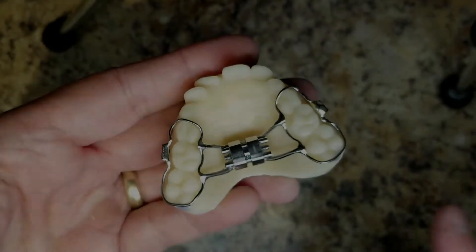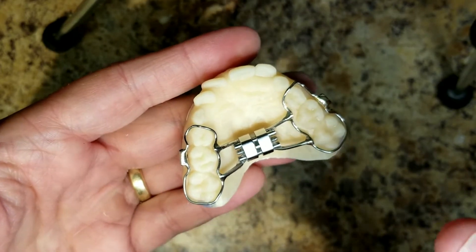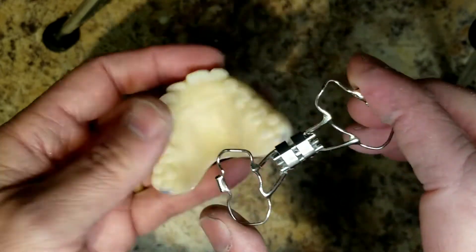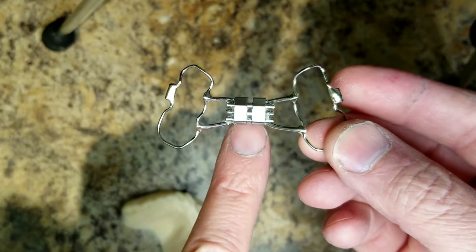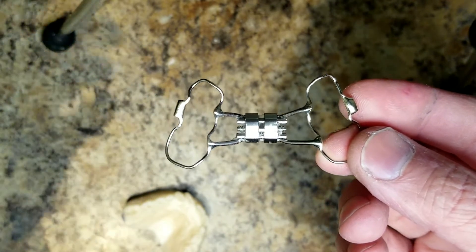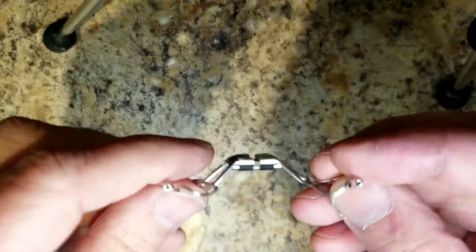Here's a really simple tip that's going to help you if you're making bonded expanders, especially if you're using a biostar and you're going to put a thermal disc or any type of acrylic over the teeth. You want to protect the screw and make it a lot easier to finish. Recently I forgot to do my little trick and I spent an extra hour cleaning these all off — complete waste of time. It's really hard to get the acrylic out of these spindles.